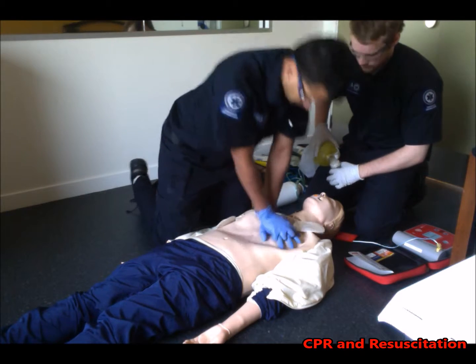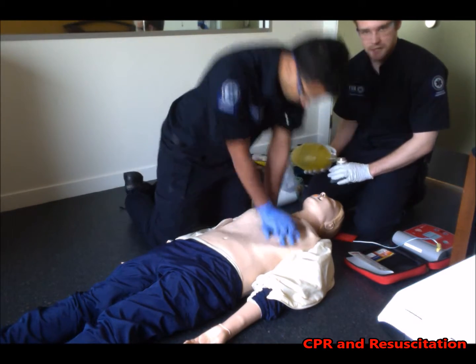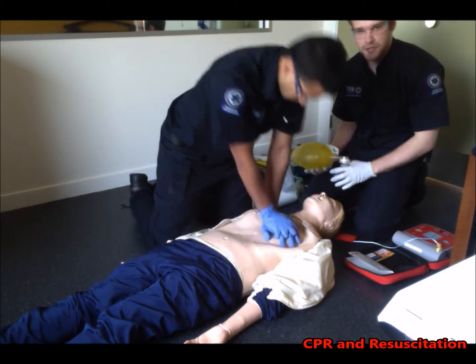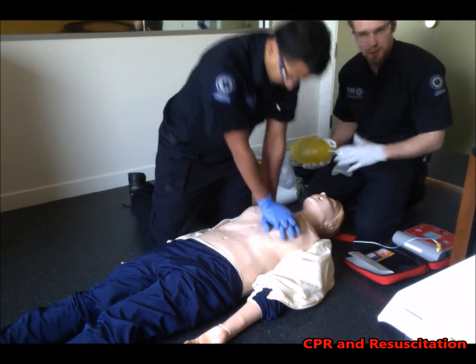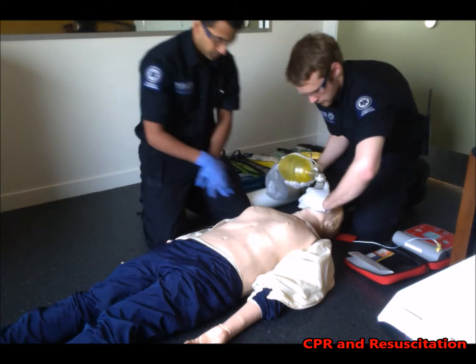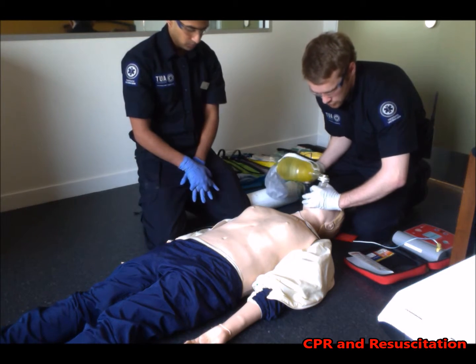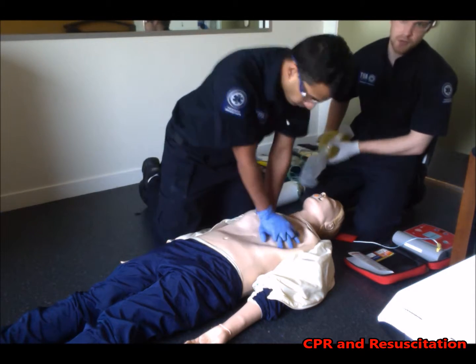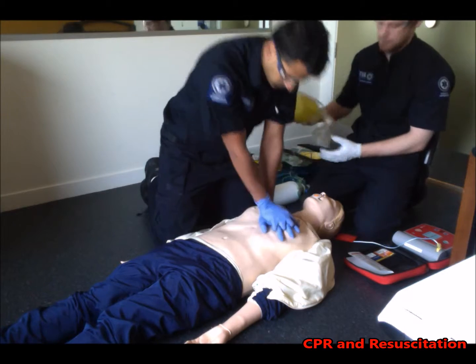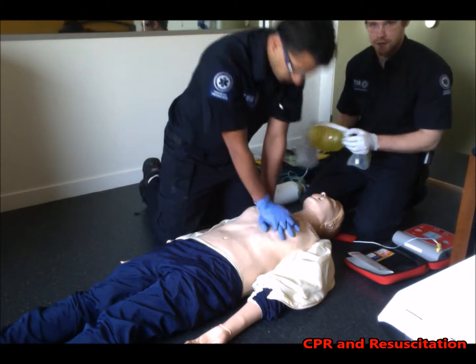So Dave, can I get you to continue doing that? 30 compressions. While this is happening, we want to attempt to gather some sort of patient history, or try family members or bystanders. So a C grip, and just ventilate twice. 1, 2. Checking for chest rise, and making sure that the seal here is adequate. If not, we can always troubleshoot if needed.